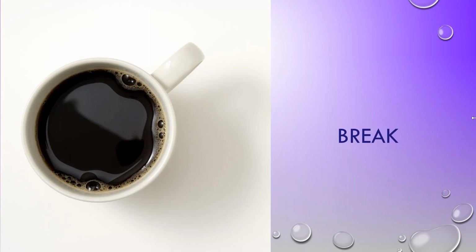So in the resuscitation and when intubating, it's very important that we count it down and tell the doctor. But be careful with the way that you carry it across, because if you sound distressed, they will get distressed. So just say, we're down to 90, we're down to 85, we're getting to 80, can we restart? Just so that that doesn't happen, because I think more importantly than a leak, that's where we see damage happening.